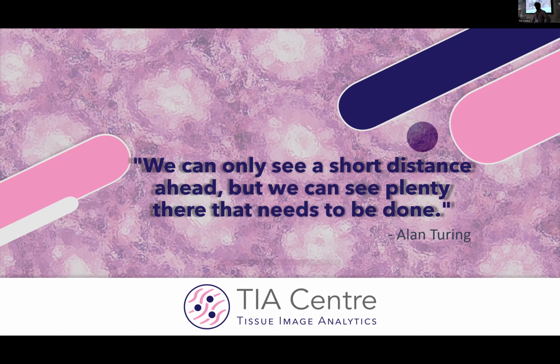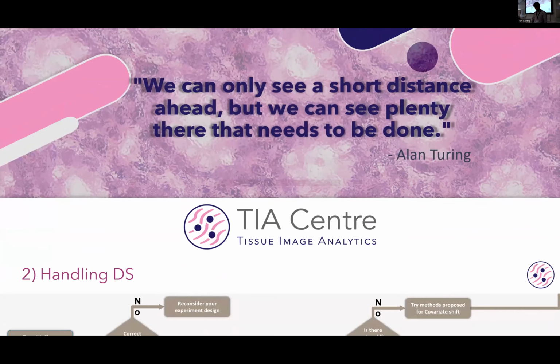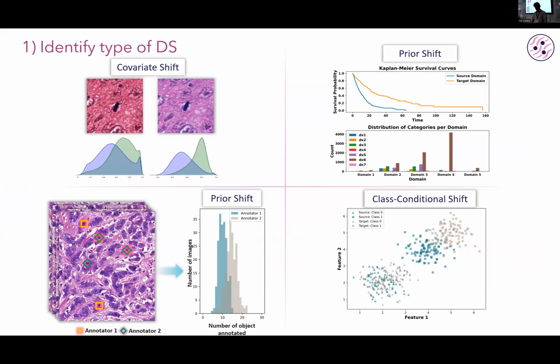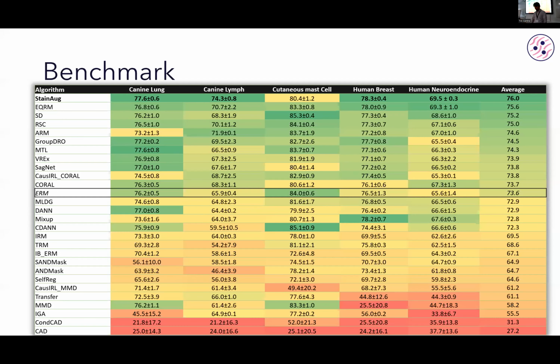Good question. In your comparative analysis, you compare the different domains and validation methods. Did you try anything that does that extreme kind of augmentation that was talked about this morning? Not really. Apart from standard data augmentation techniques like translation, rotation, and scaling, we also used color augmentation, except for stain augmentation, which is some sort of causal augmentation for the problem that we have. So not really extreme augmentations, but they ought to work better if you add those.